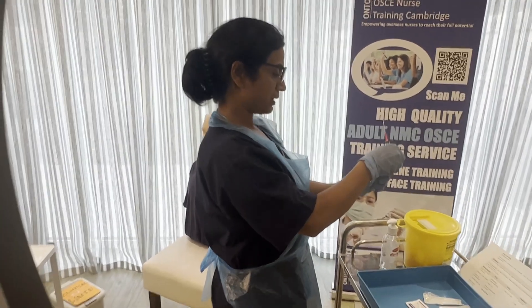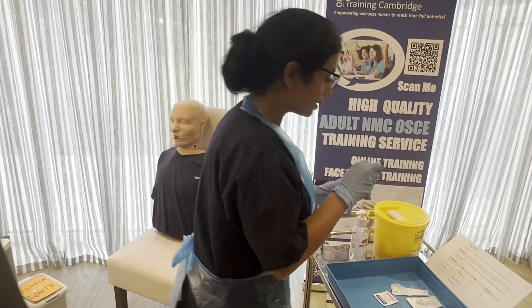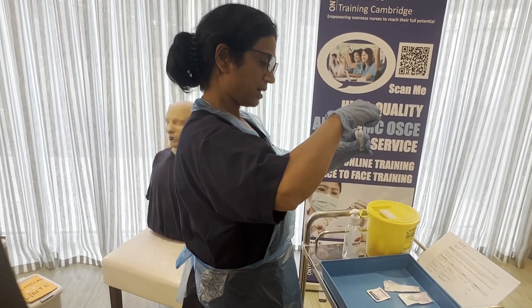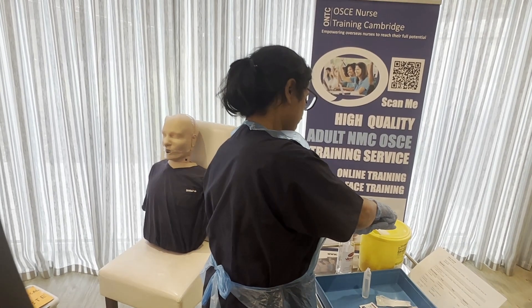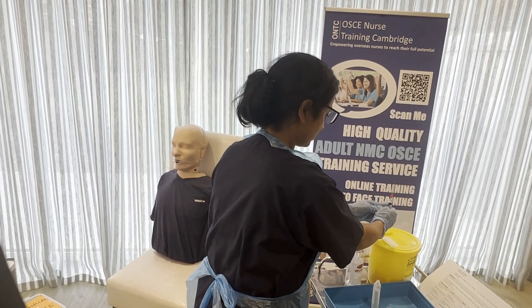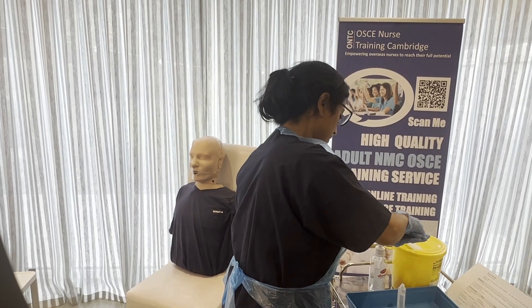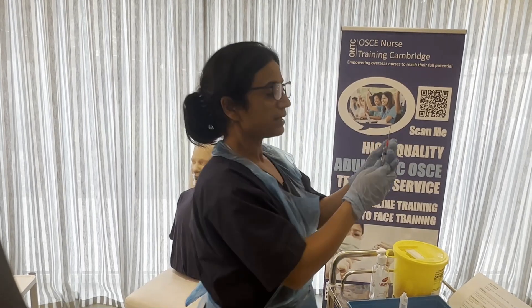In the exam they only give you plastic vials, not glass. We're going to draw up our medication according to the prescription — it's one mil — so we're drawing up one mil. We'll expel any air over the top of the sharp bin. That's our one mil of injection ready.